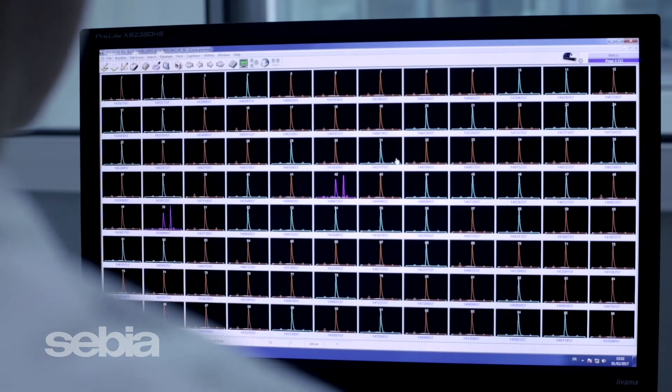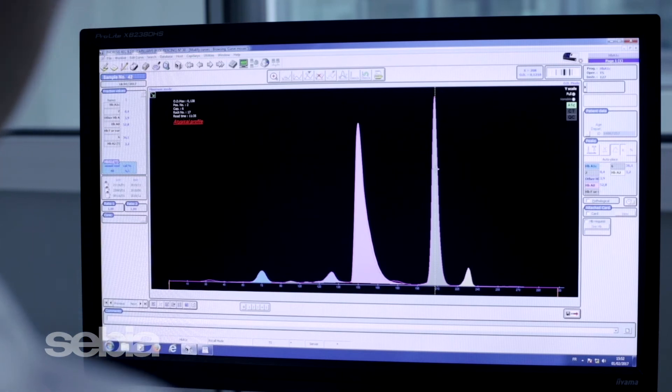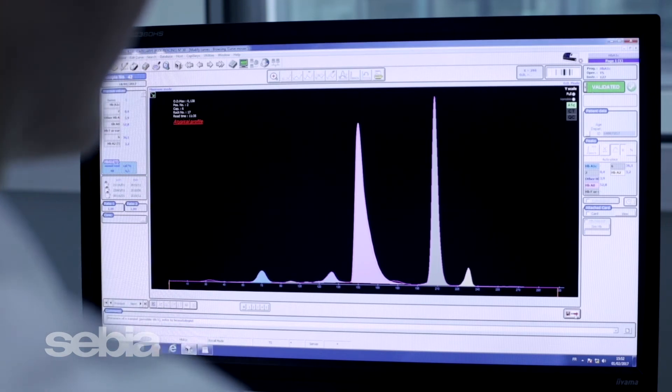Once samples are processed, ResultReview takes place in our Phoresis core software. Users can customize ResultReview to best fit their needs and workflow with our intuitive, easy-to-use software. Results can also be automatically released to your LIS, based on your lab's criteria.